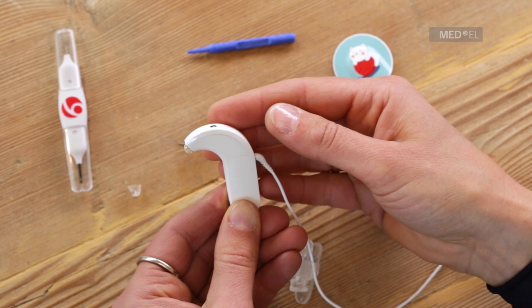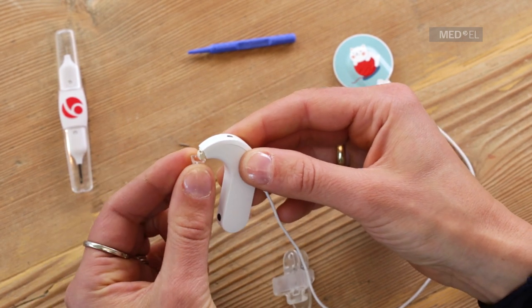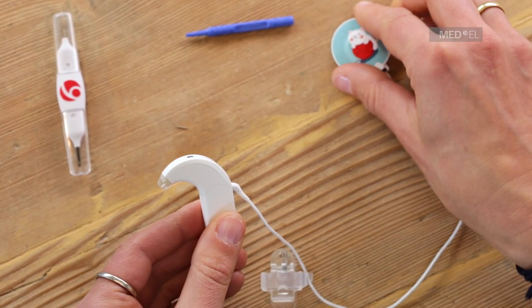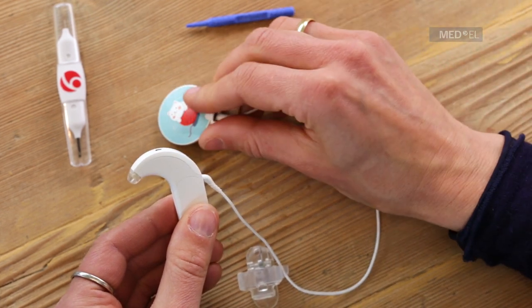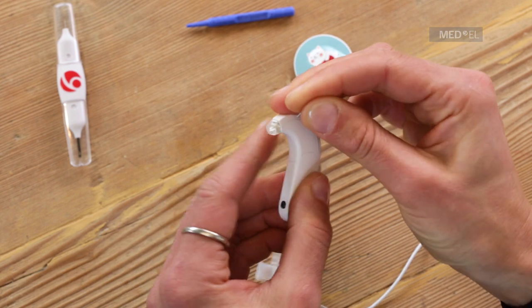Place the baby wear ear hook cover over the lip on the lower part of the control unit and gently push upwards until it snaps into place. Then reinsert the ear hook pin to secure the cover.